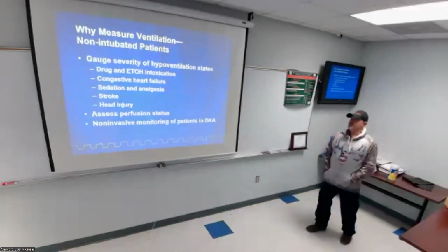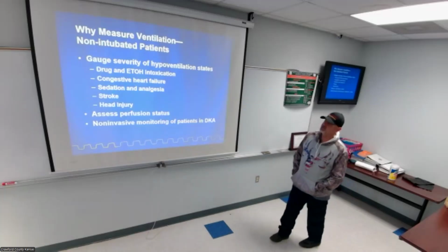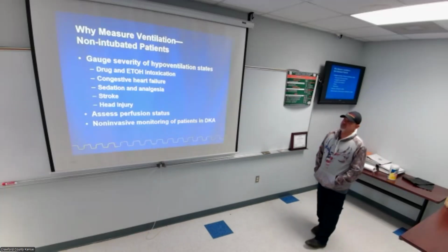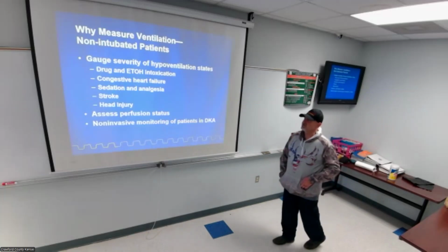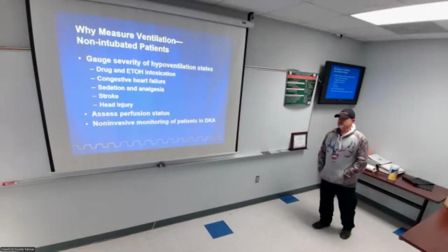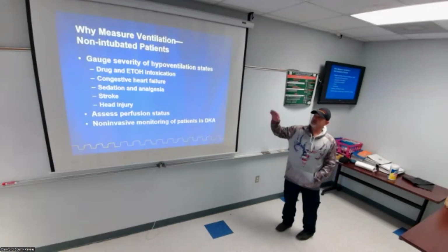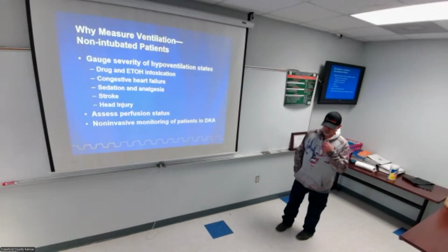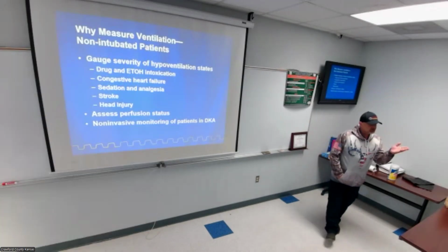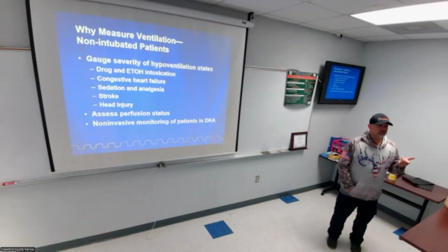So, some hypoventilation states. So we're going to have some still increased end-tidal CO2: drug or alcohol intoxication, congestive heart failure, sedation, analgesia, stroke, head injury. What's all in common with these patients? Level of consciousness, and what's their breathing pattern? Either irregular or slow.